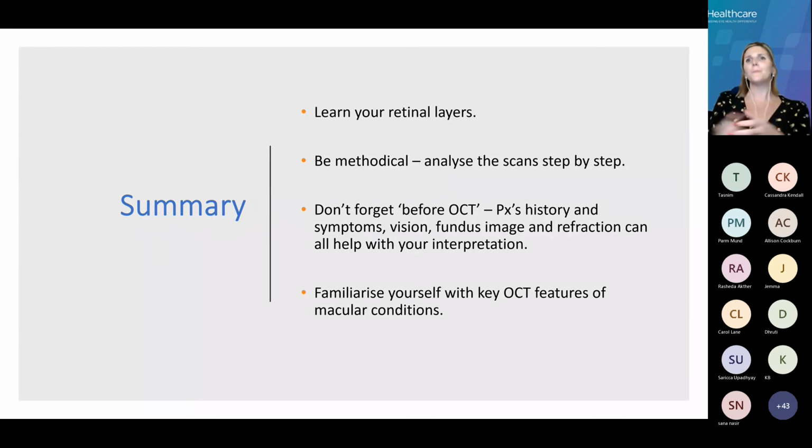What's best is for you to remember that you know, as clinicians, you've been looking after patients for many years without OCT, that actually that extra bit of story, that extra bit of information is how you're going to look after and monitor and especially educate those patients. That's a big thing these days, is educating and communicating with them. So don't forget, before you had OCT, patients' history, symptoms, visions, fundus images, refraction, all help build interpretation.